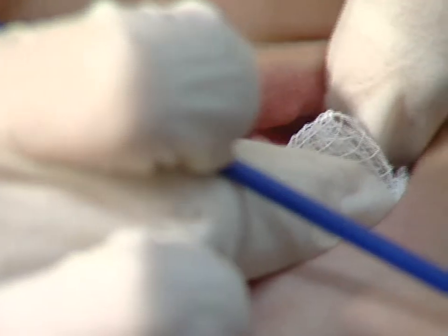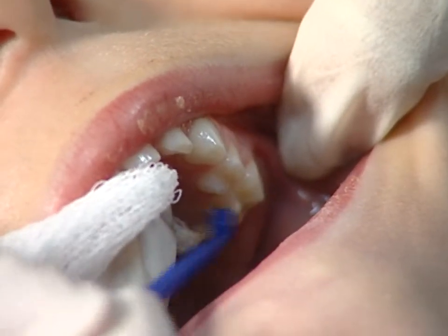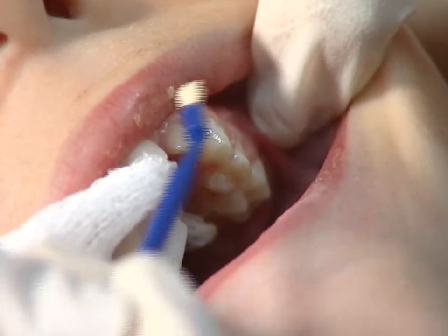Older children have more teeth and you will have to start by applying the fluoride varnish to the back teeth. Dry the teeth in the upper left corner of the mouth with the gauze and paint on the fluoride varnish. Be careful to hold the tongue and cheeks out of the way. In this case, we are using enamel pro varnish.